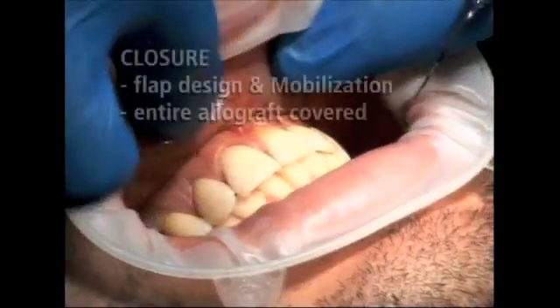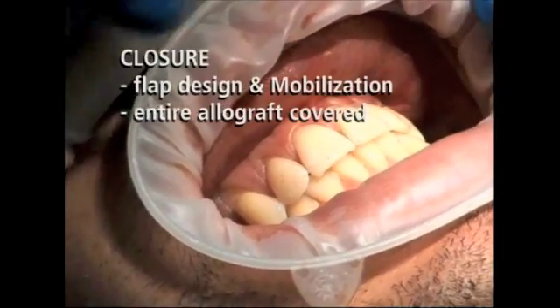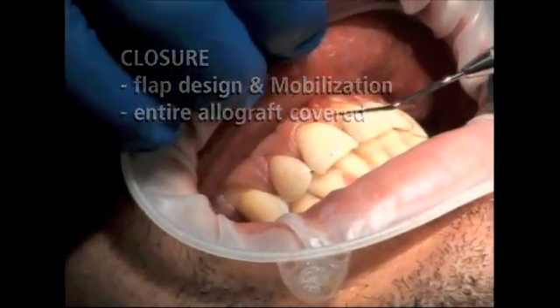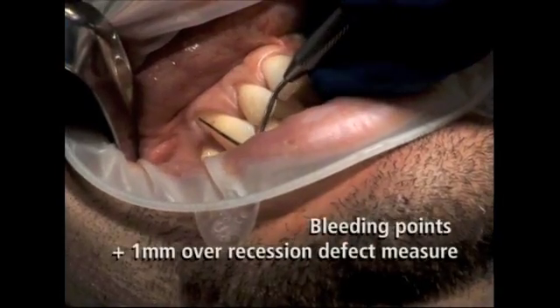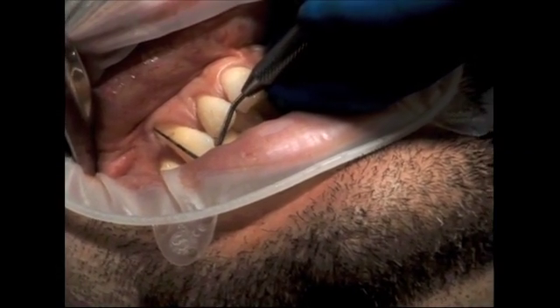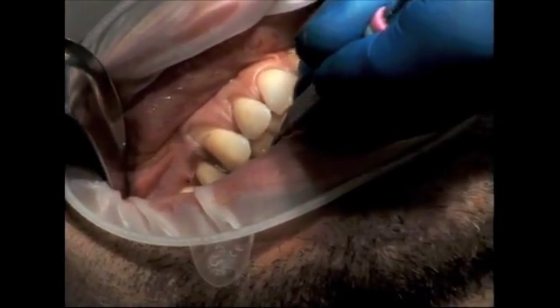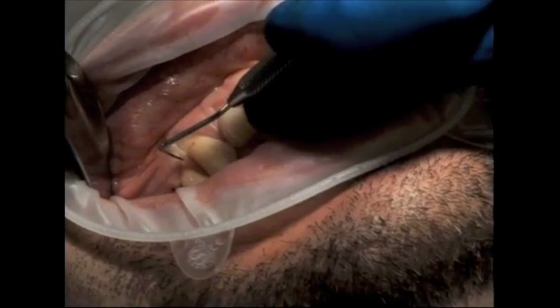Before getting started with the surgery, I often like to perform a preoperative examination in order to assess the severity of the recession defects. In addition to the amount of recession and the level of the interproximal bone radiographically, I also assess the quality of the surrounding gum tissue, whether the tissue is keratinized or attached, how shallow or deep the vestibule is, whether dark triangles exist, the mobility of the teeth, wear patterns, and whether the teeth are supererupted. All of these factor into the degree of root coverage that can be expected.